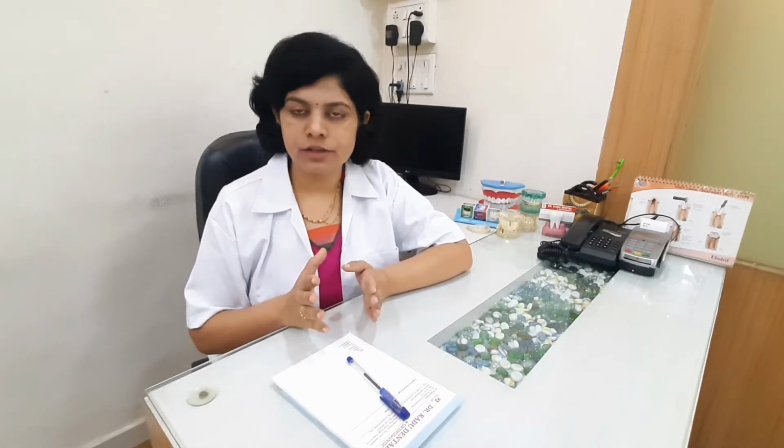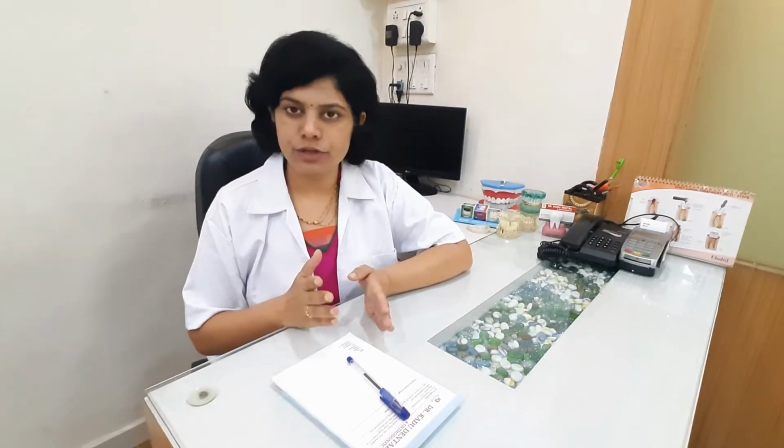In a few patients having cardiac disease or who have already had a heart surgery related procedure, precautionary antibiotics are also given. Patients who are on blood thinners, with the help of the physician's consent, have these medications stopped for a few days prior to the implant placement surgery. In some cases, physician consent for the overall fitness of the patient is also asked for.